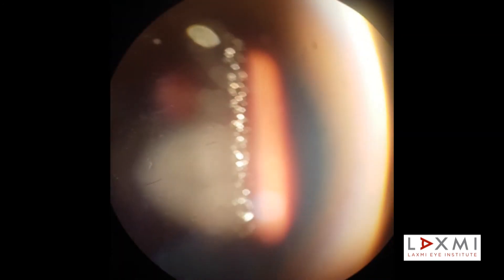Now the same procedure is followed with a 78 diopter lens. Note the difference in the magnification and the field of view.